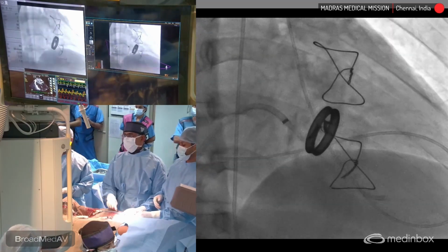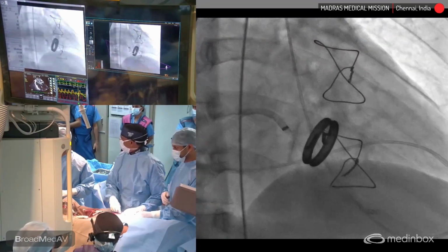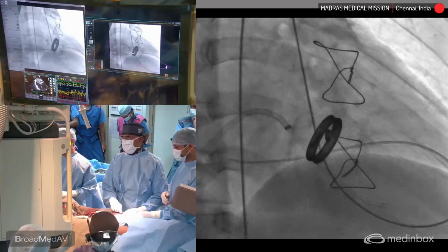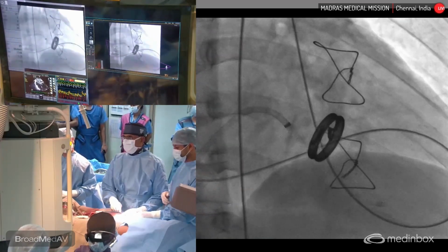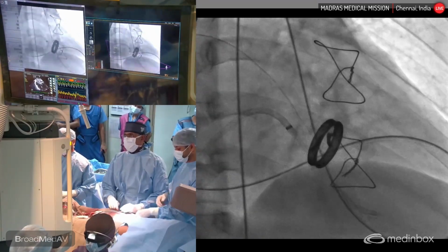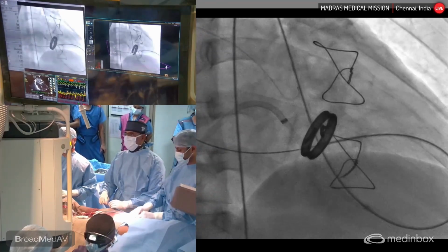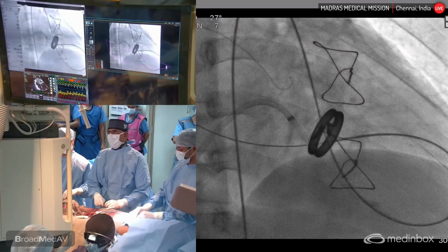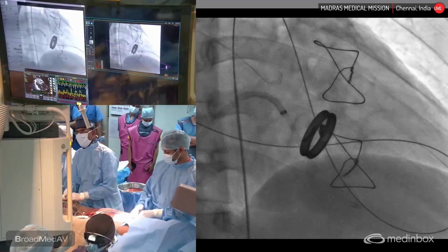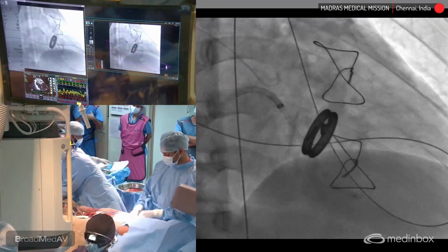We'll get ready a 6 French right coronary artery guide catheter, but that needs to be longer. Do we have any longer guide catheter that is a little more than 100? We don't have, right? Okay. This is a practical problem that we'll get because the patient is tall. Let us try to see whether the stiffness of the Amplatz super stiff guide wire will enable us to get the 100 centimeter right coronary artery guide catheter.